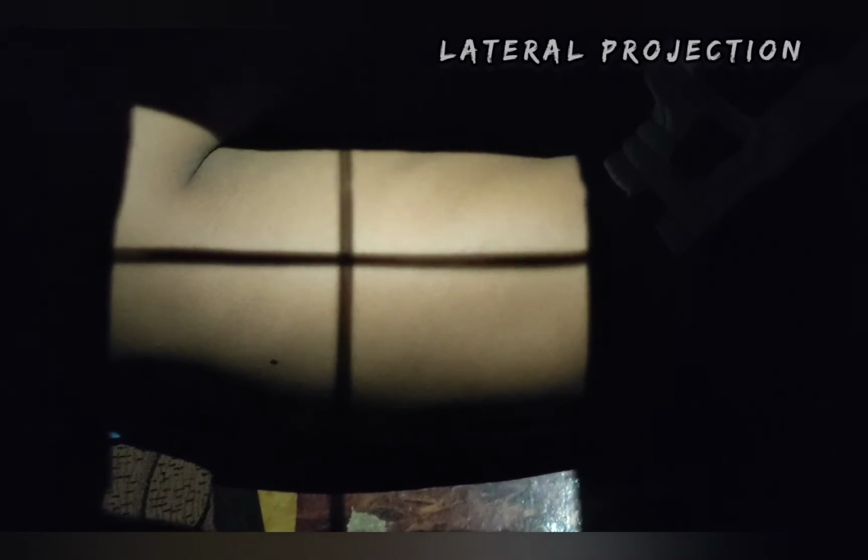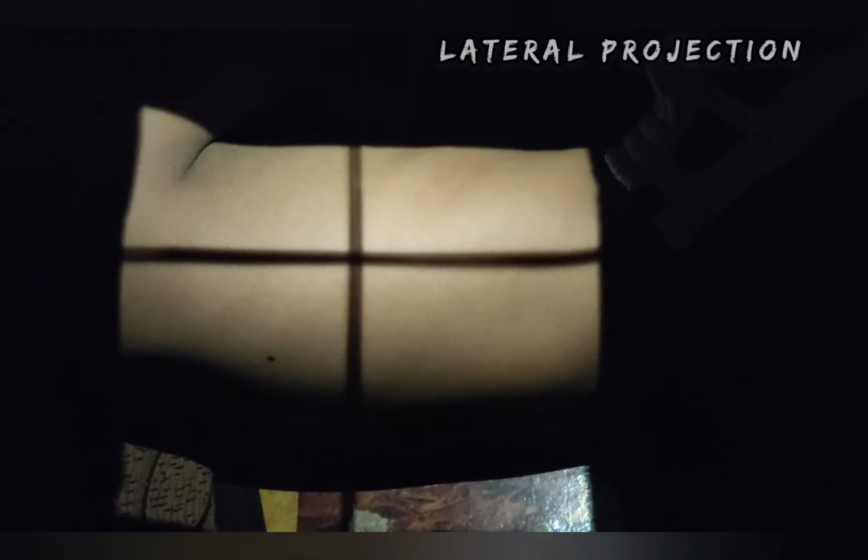Lateral projection, thoracic spine. Patient position might be lateral recumbent or erect position. Part position, raise patient's arms to right angle to body with elbows flexed. Ensure that there is no rotation of shoulders or pelvis. So CR is perpendicular to IR, perpendicular to long axis of thoracic spine, direct CR to T7 below the jugular notch.